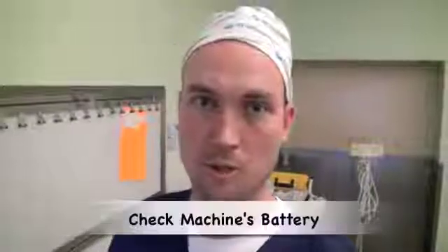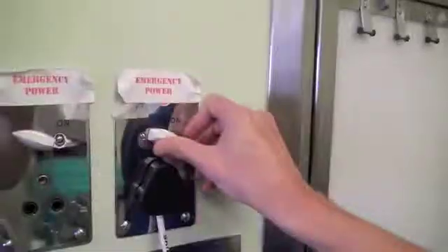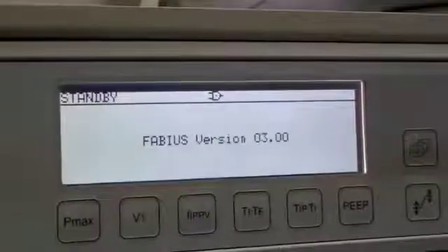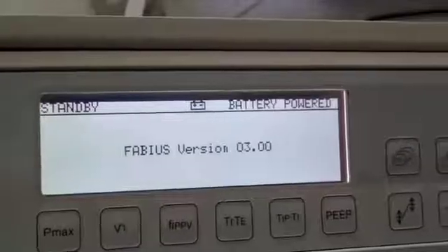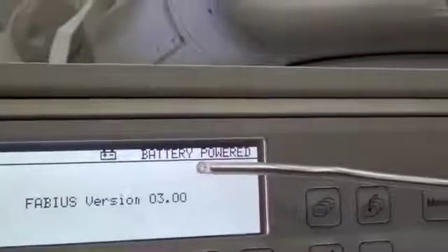It is also important to check that the machine's battery is fully charged and functional. This can be done by turning off the main power source to the machine. The machine will then indicate that it is now running on battery power.